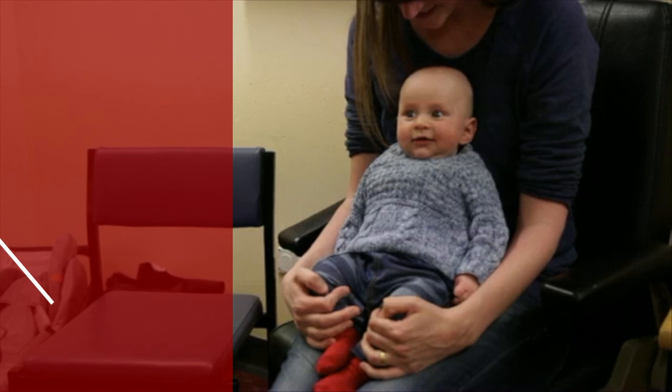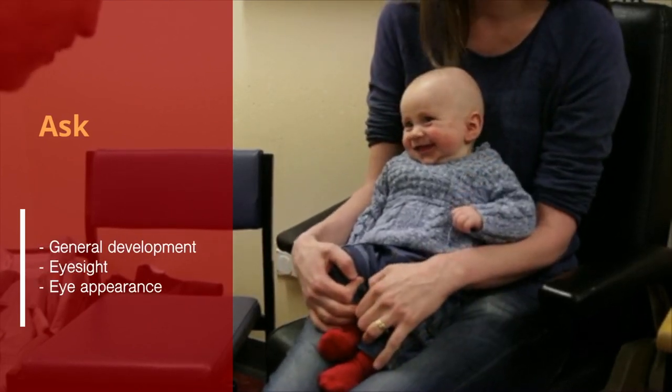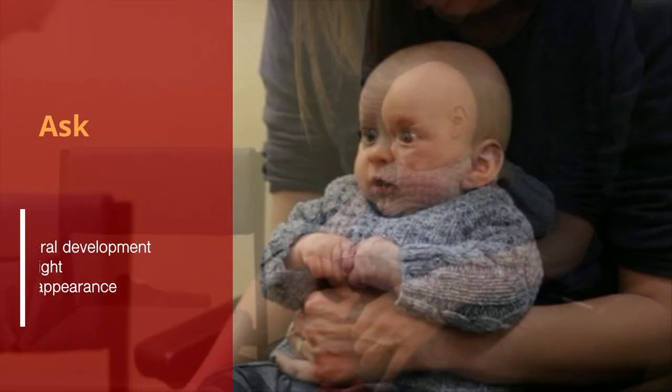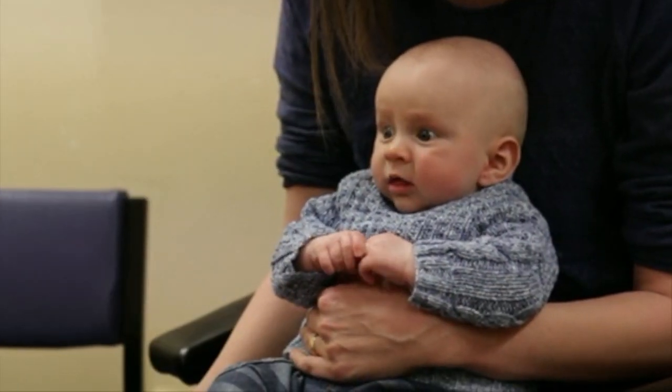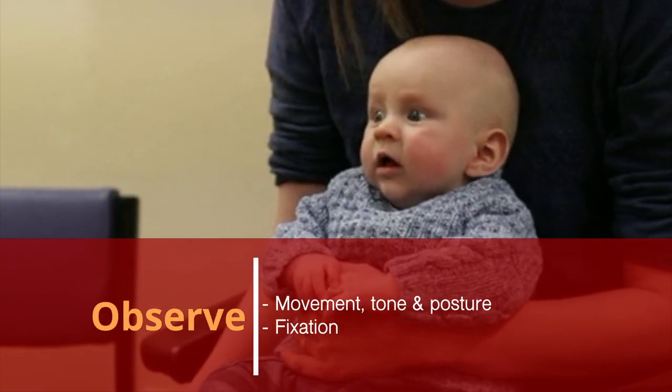Start by asking if there are any concerns about general development, eyesight or the appearance of the eyes, then make some observations. Get a sense of the baby's general and visual development by looking at the way they move, their tone and posture, and how well they can fix on your face and eyes.